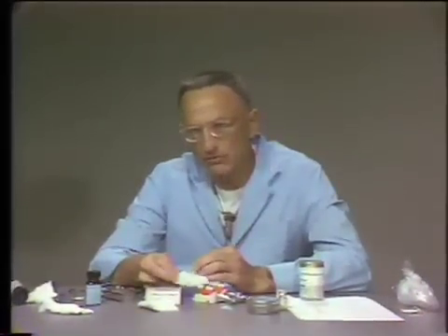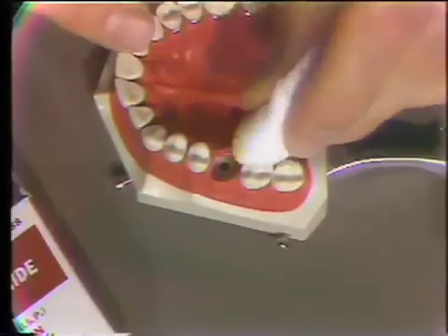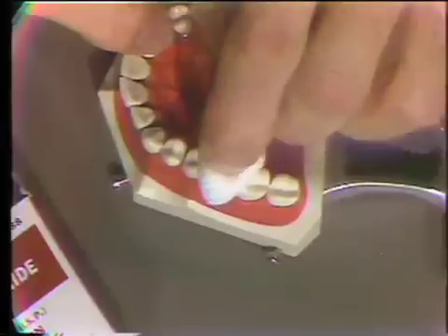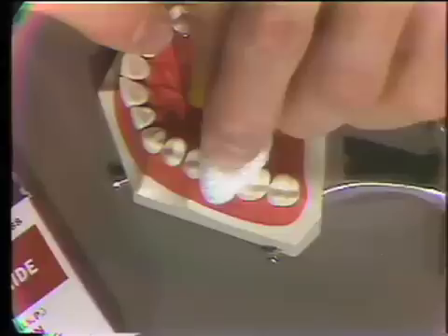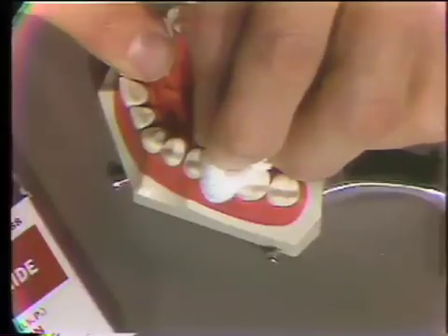These are chiefly applications of pressure, varying from the utilization of sponges. Ordinary gauze sponges are used for compression — we make small rolls and insert them over areas where we hope to control bleeding. For example, if a tooth is missing after extraction in this typodont, we would place a gauze roll firmly into this region, packing it in position and having the patient bite down on it.